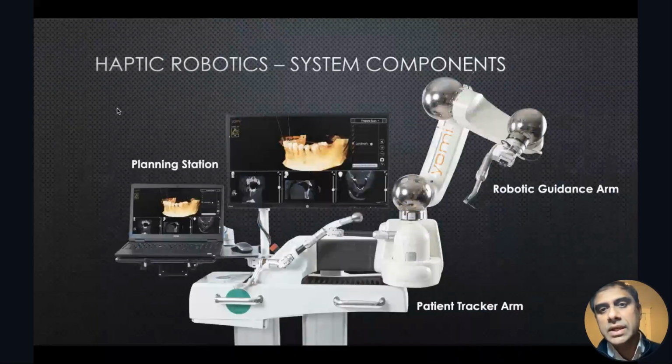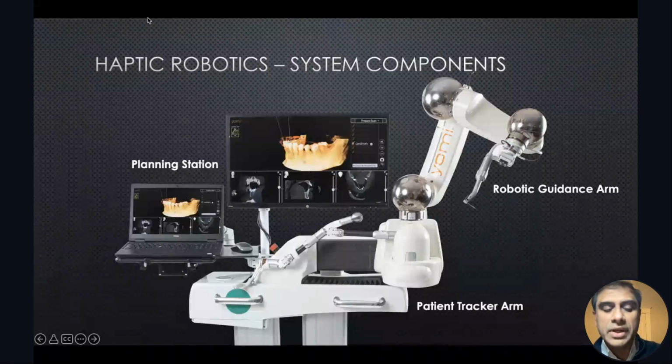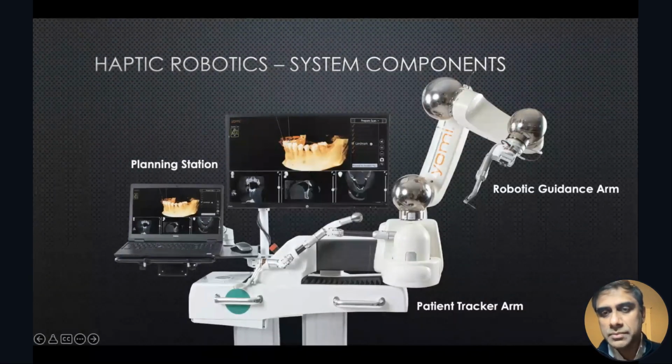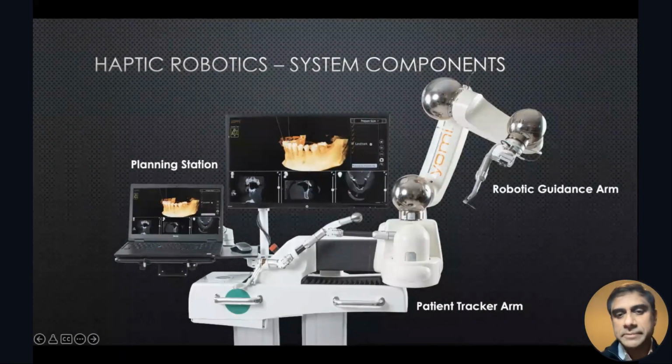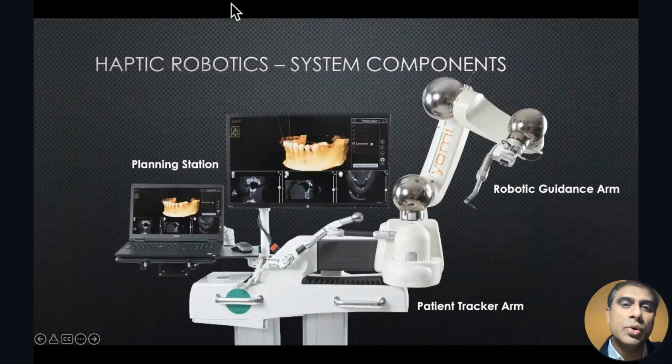And soon I think it's going to be history, and it'll be easy for you to place pterygoid implants and zygomatic implants, because you're not going to get patients into your practice with ideal ridges or ideal sinus positions or locations. Then how are you going to address those things? And imagine if you're able to use dynamic navigation for those kinds of implant placements, it's a huge deal. So it's coming.